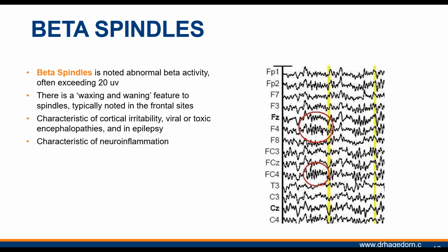But I just wanted to review, I know some of our physicians aren't very familiar with why we even give you a section of the raw EEG data on the comprehensive report. And this is one of the reasons why we want you to be able to recognize beta spindling. And really the only way to do that is for you yourself to look at a snapshot of the raw EEG. So you're looking for those tightly dense little squiggles up and down just for a split second, and then they're going to go back away.